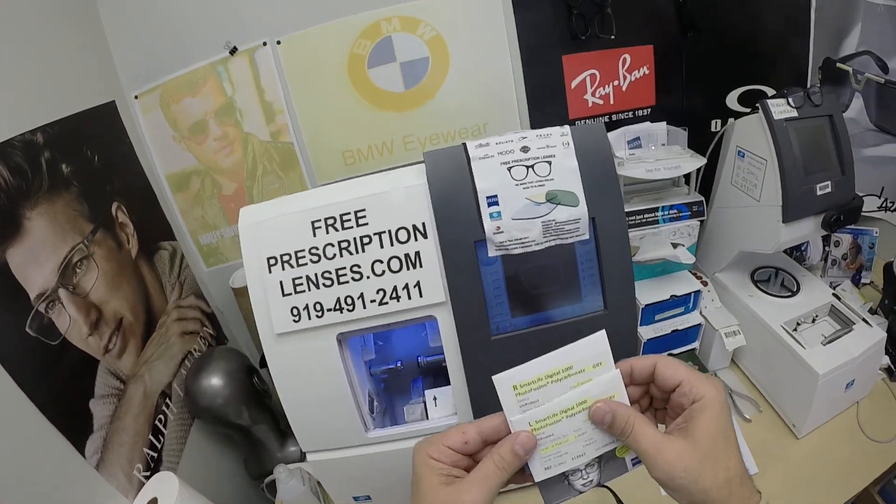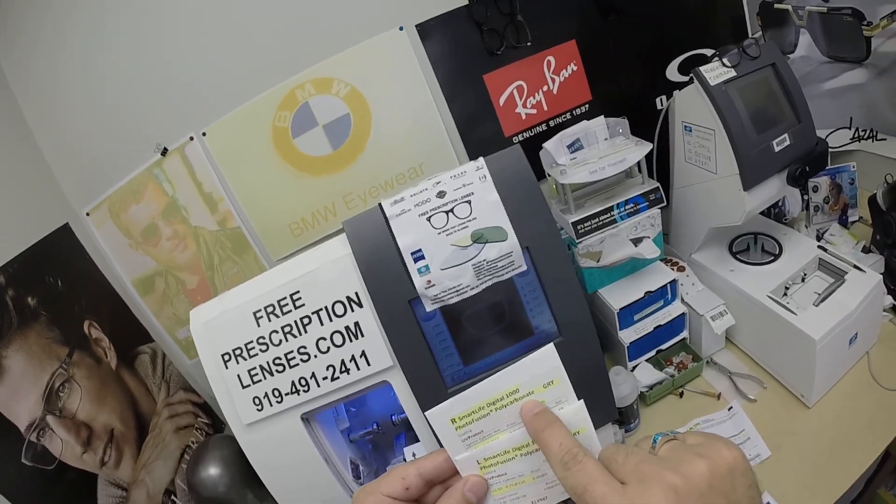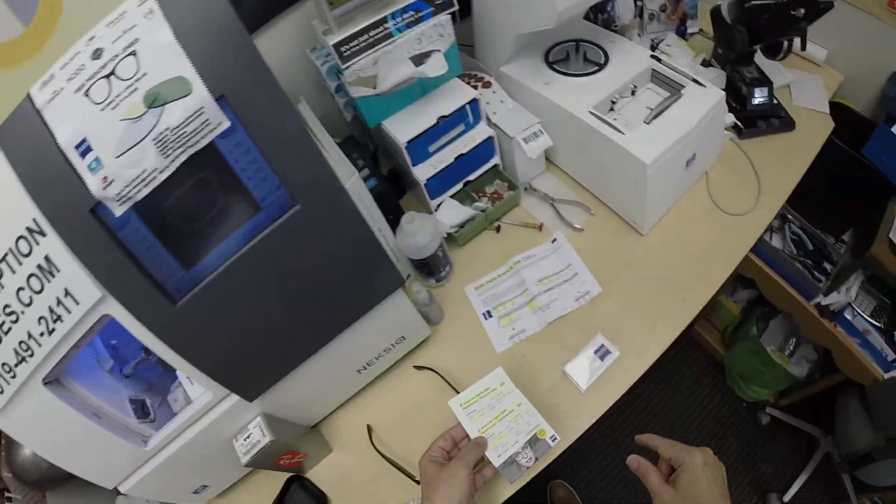The packets that the lenses came in: for the right eye and the left eye, the Smart Life Digital 1000 Photo Fusion Polycarbonate Gray. Custom color with highlighted prescription for the right eye, same for the left.